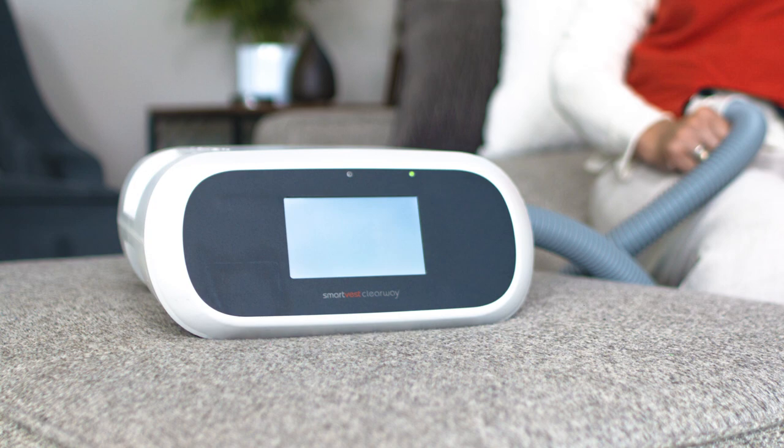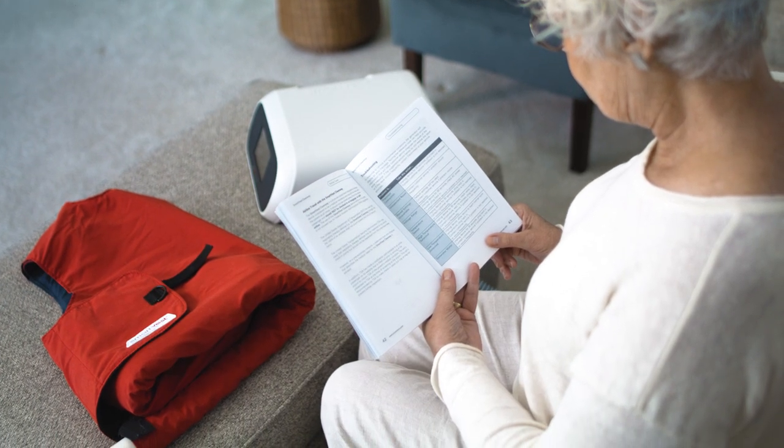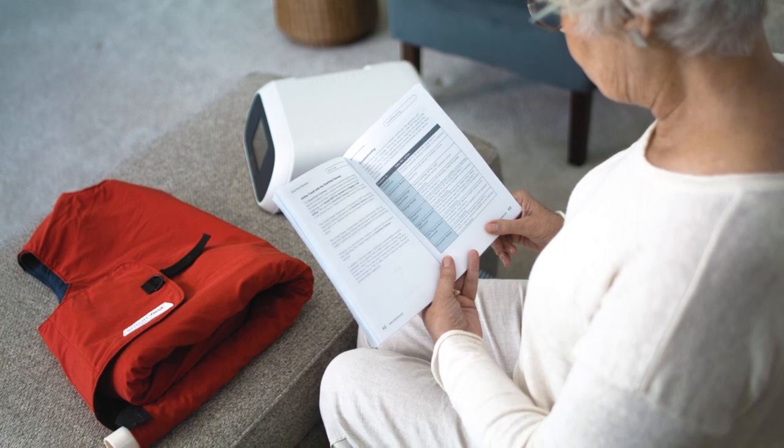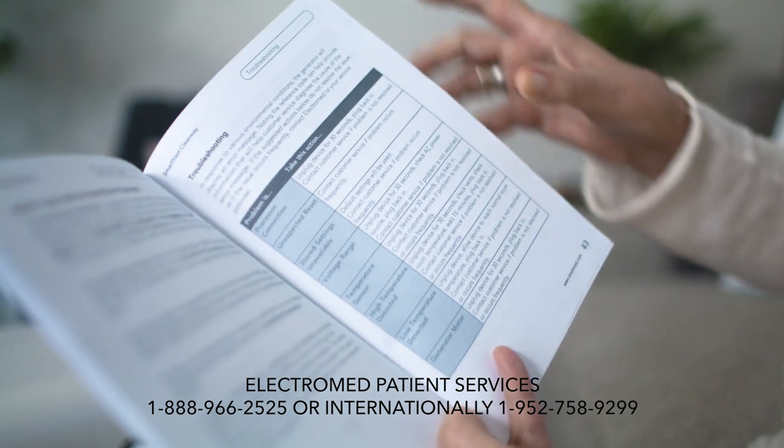If the generator is securely plugged in and not in sleep mode, check the troubleshooting section of the instruction manual. If these troubleshooting efforts do not restore the performance of the SmartVest Clearway generator, call the ElectroMed patient services line for assistance.